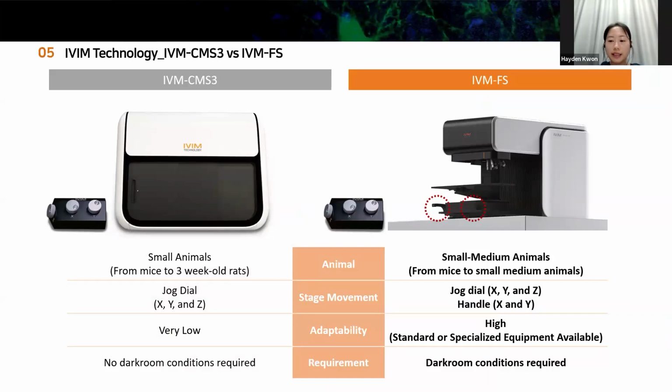I would like to highlight some of the unique features of the new free space system compared to the previous confocal and multiphoton system. Most components, including the laser, lenses, and other internal optical structures remain almost identical. So you could use both confocal and two-photon in the same microscope, not only for small animals, but also for mice, rats, ferrets, and guinea pig-sized animals.